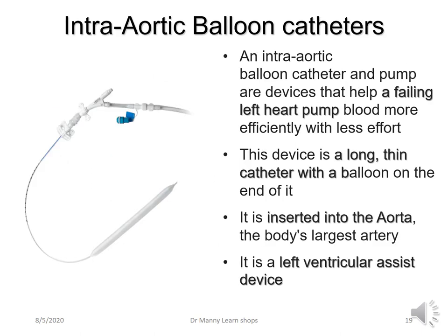The intra-aortic balloon catheter and pump are devices that help a failing left heart pump, to help it pump more blood efficiently with less effort. It's a left ventricular assist device. It helps the ventricle work better and with less stress.